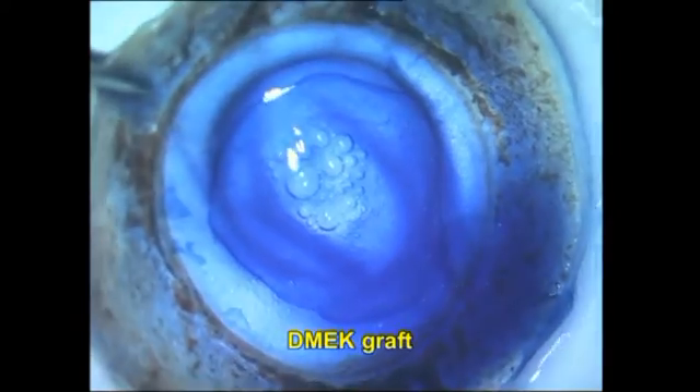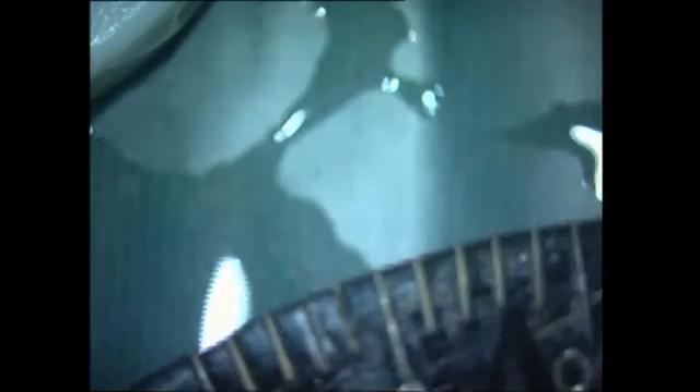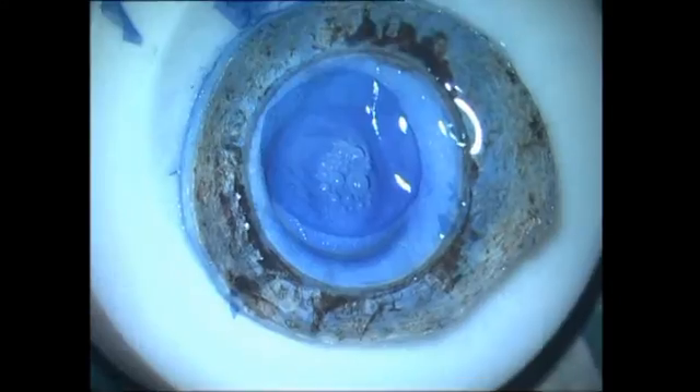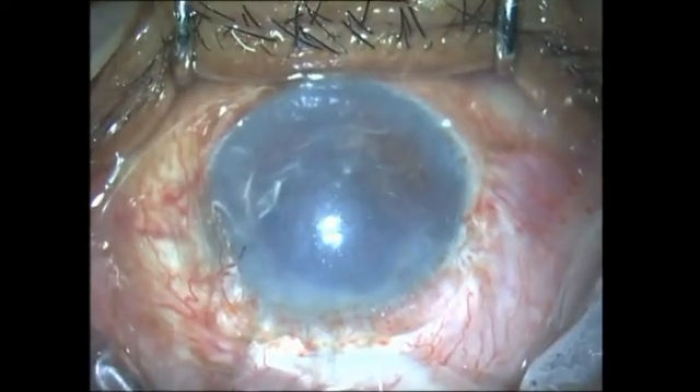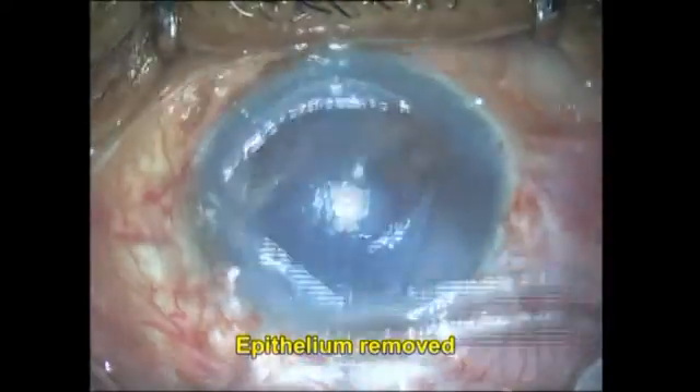I go ahead and stain the DMEK graft now. An important point: when you are enlarging a DMEK graft using storage medium or air, you have to be very careful and very slow, because it can burst much sooner than a pre-Descemet's endothelial keratoplasty graft.